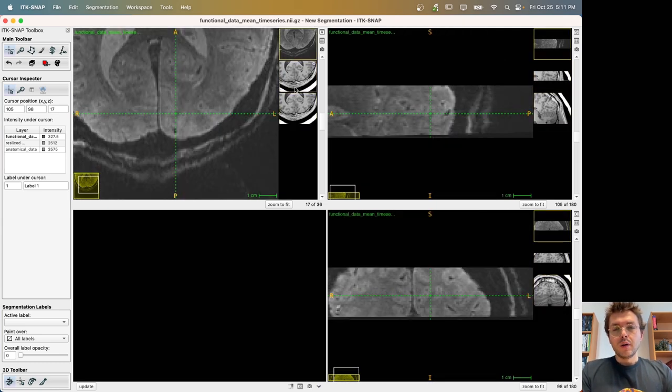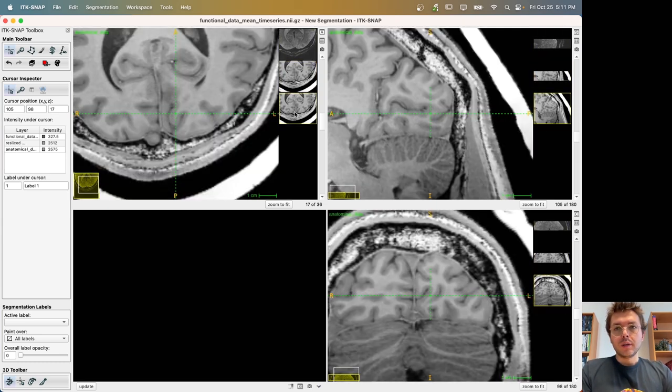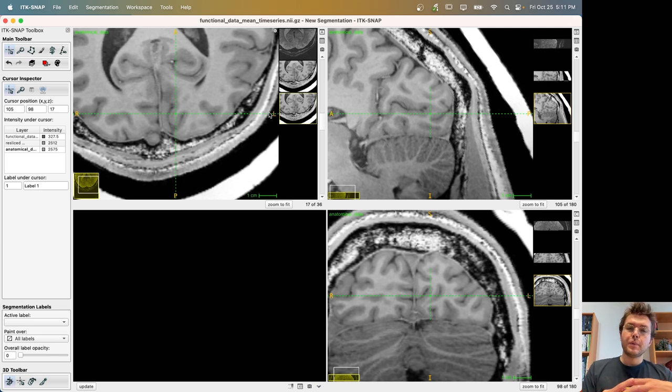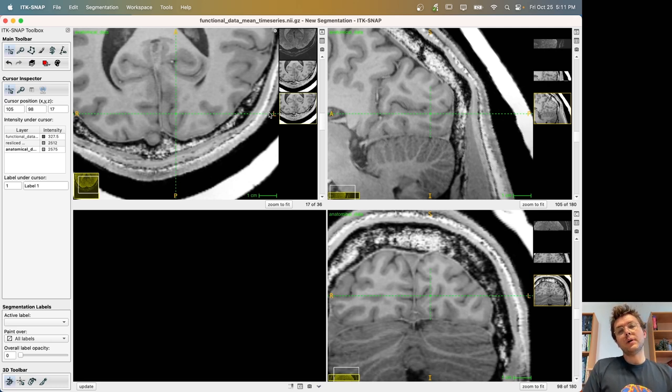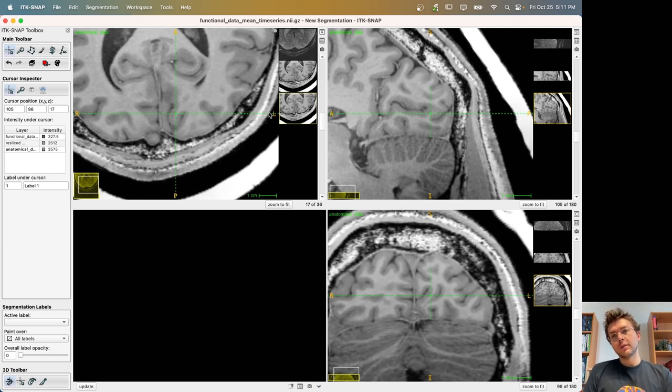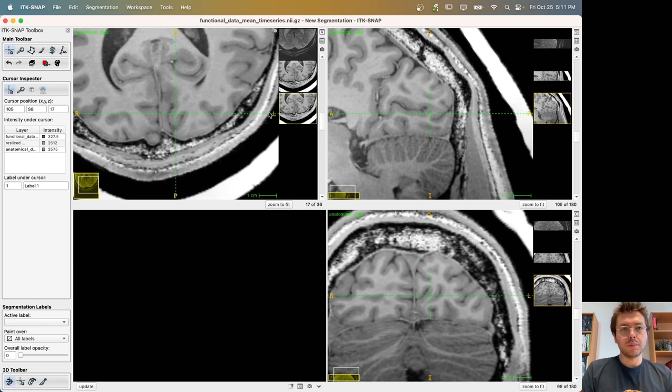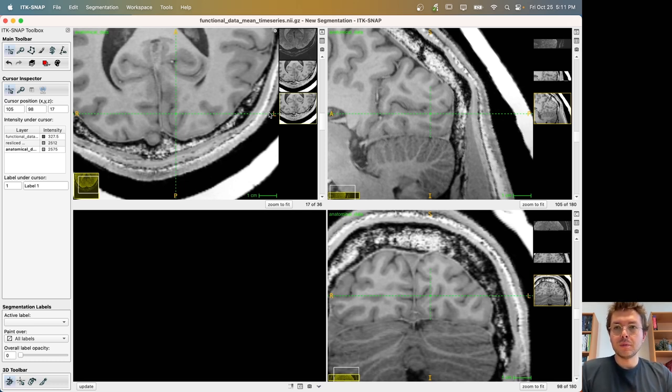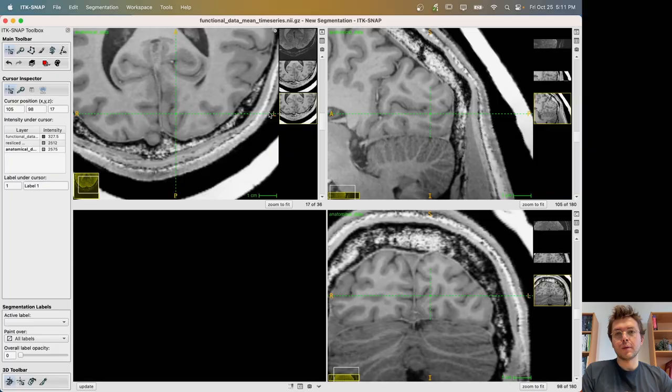So this is how you bring the anatomical data on top of the functional data using some regions of interest to optimize your registration. I hope that this is useful for some of you. And thank you.